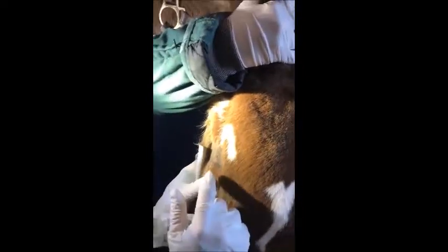You can see the foal's jugular here. If you have to, you can clip the hair a little bit. You can see it coming right up right there — if I let down, it goes down. It's very clear, very obvious, very wide vein.